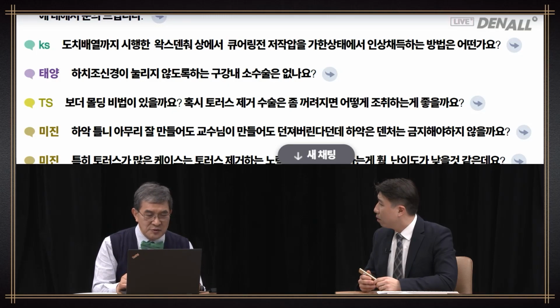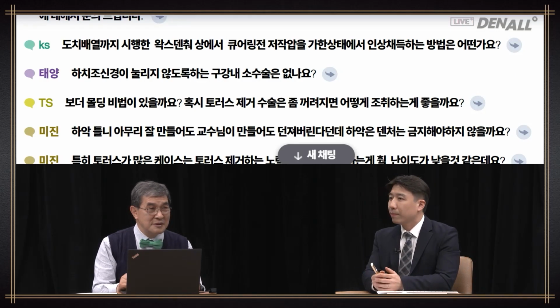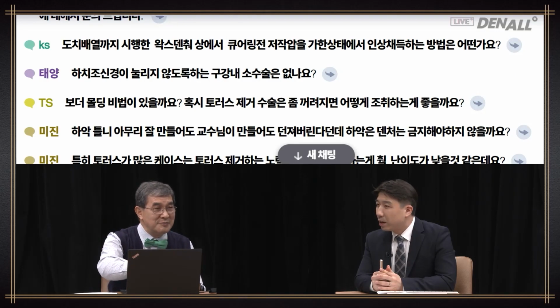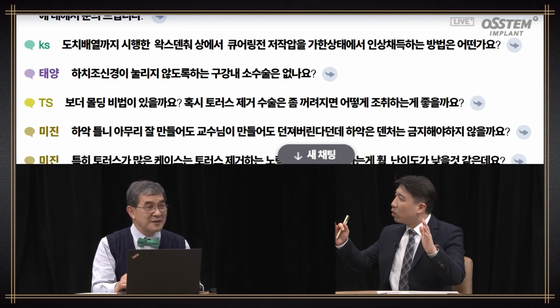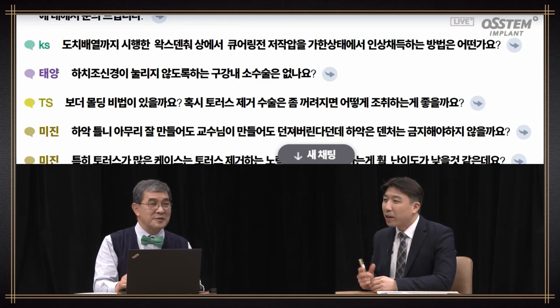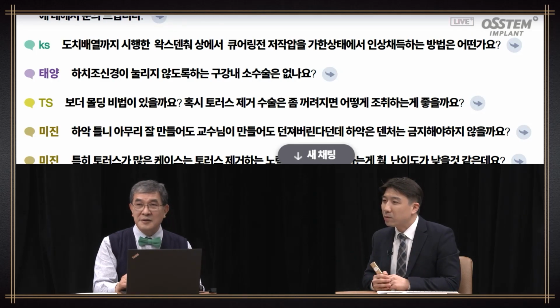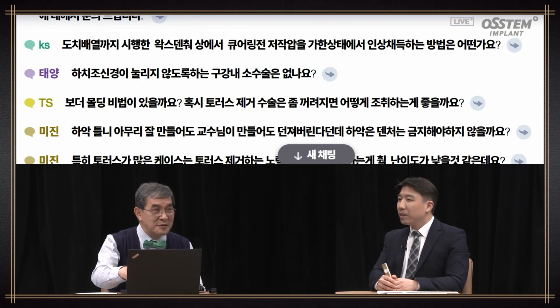In a wax denture with denture teeth alignment, before curing with masticatory force applied, how can I take an impression? Taking an impression in a wax denture, is it easy to do? I'm thinking that the base is made of resin. If the record base extension is appropriate, you can use the concept of a wash impression. You need to use materials which are very fluid. In this case, perhaps we can use a closed mouth technique.